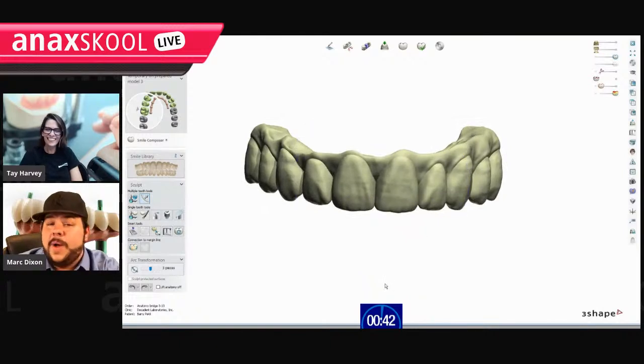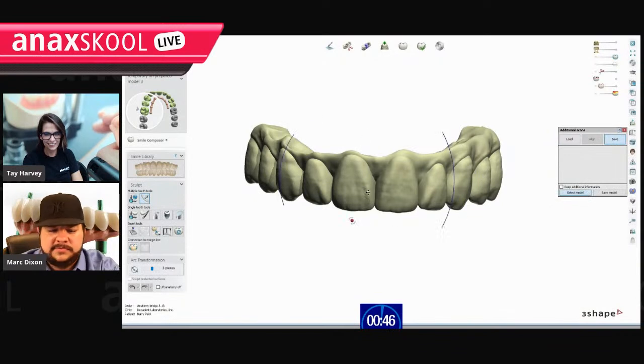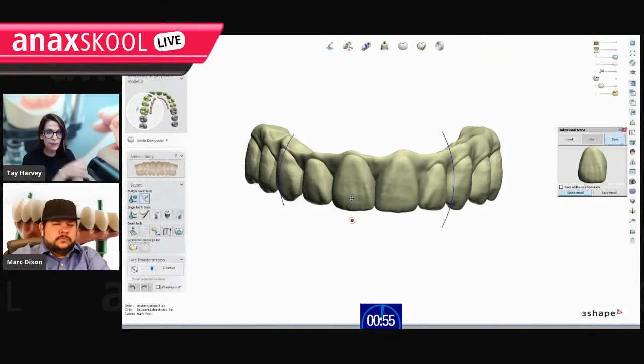So we have our wax up, right? Now, if we were in the finalized step, we could save every element. Do you see that right over on the right side of the screen? We could save every little bit now. But imagine coming back to this point, you know what the problem was. So we're going to focus on that problem. Fix it.